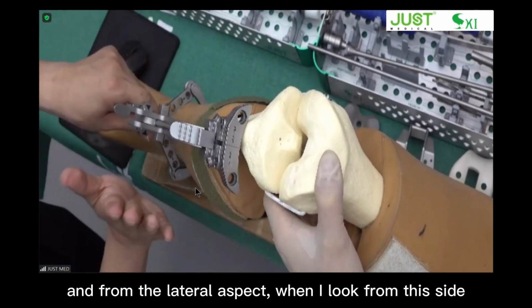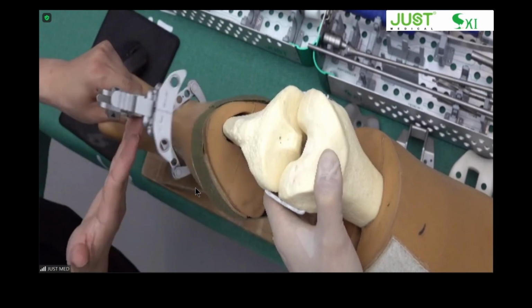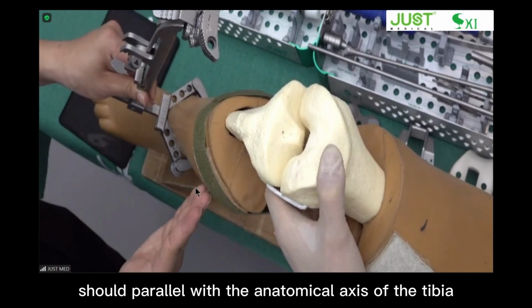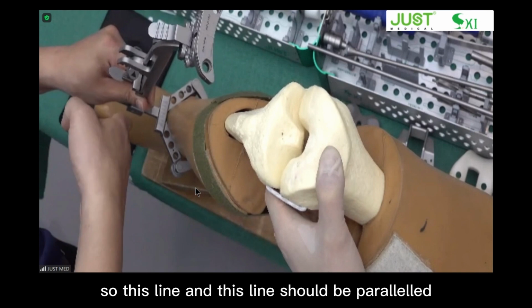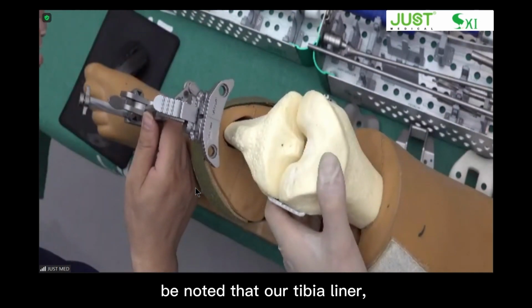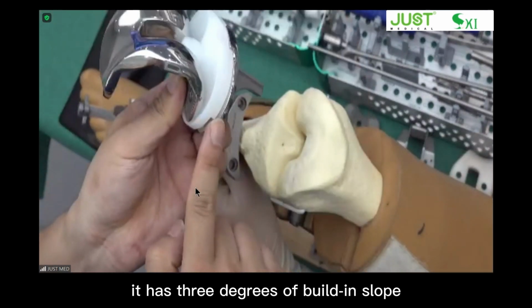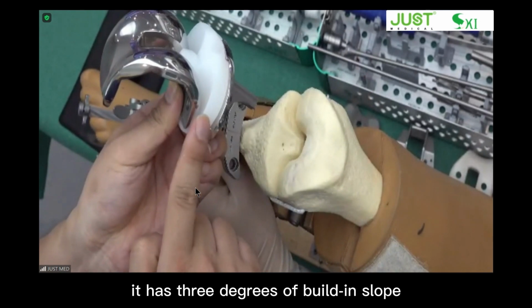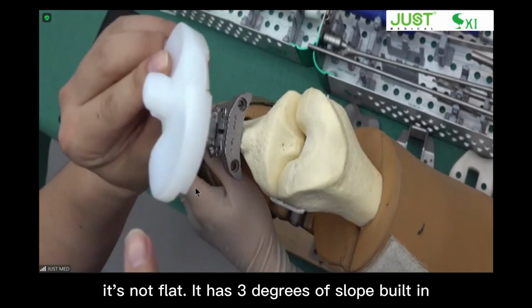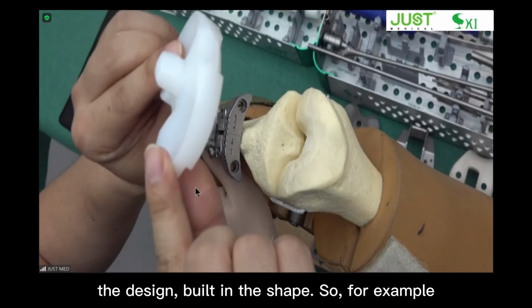Okay. And from the lateral aspect, when I look from this side, this rod should be parallel with the anatomical axis of the tibia. So this line and this line should be parallel. You noted that our tibial liner, the implant, has 3 degrees of built-in slope. It means it's not flat. It has 3 degrees of slope built into the design, built into the shape.